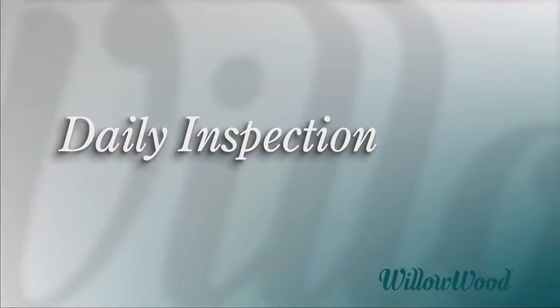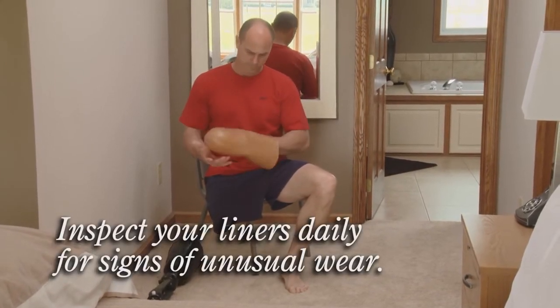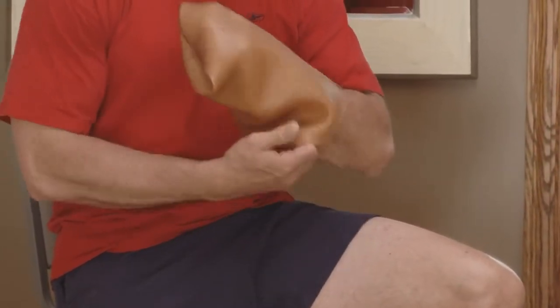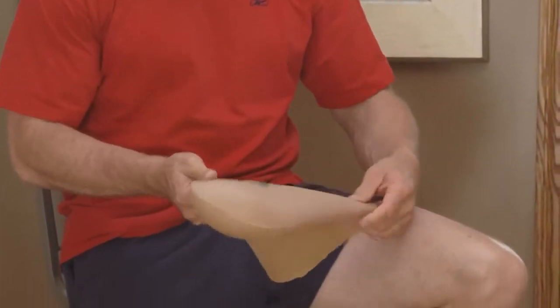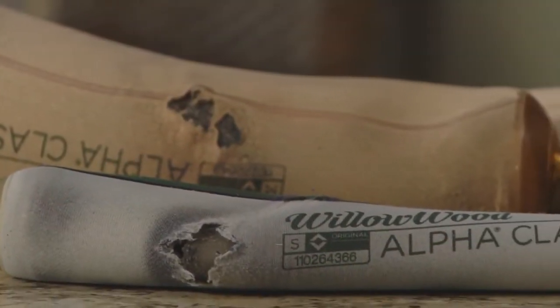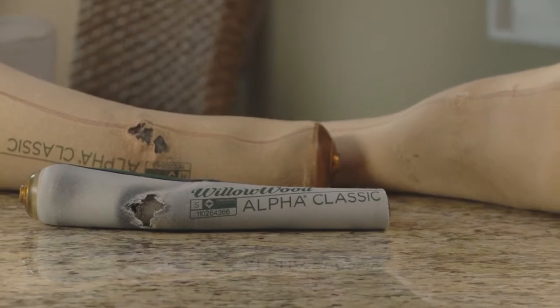Be sure to inspect your alpha liners after each day of use. Unusual wear of the fabric or gel may indicate changes in the prosthetic fit. In order to preserve the warranty of your alpha liners, be sure to contact your prosthetist immediately if you notice any signs of unusual wear. If you do not contact your prosthetist at the first sign of wear, your liner could develop more serious issues, such as the examples shown here.